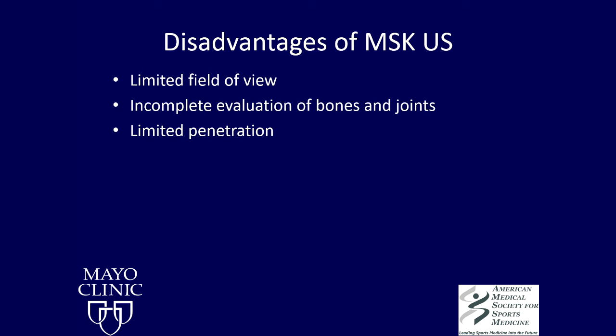So if you have a very large patient population and you happen to be looking at a structure that's small in the hip, then that might be very difficult because it can't penetrate all the way down to the area that you want to look at.